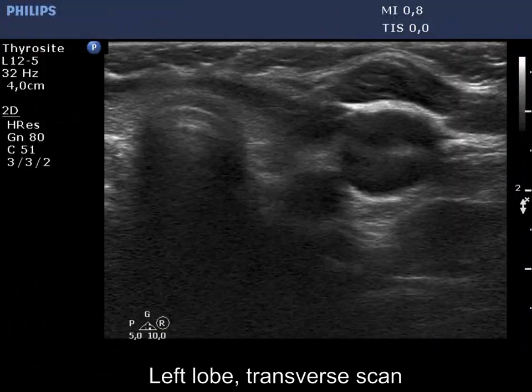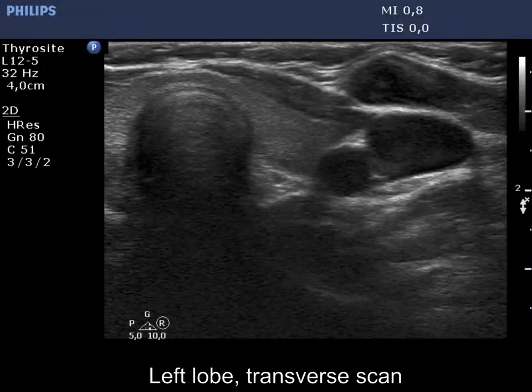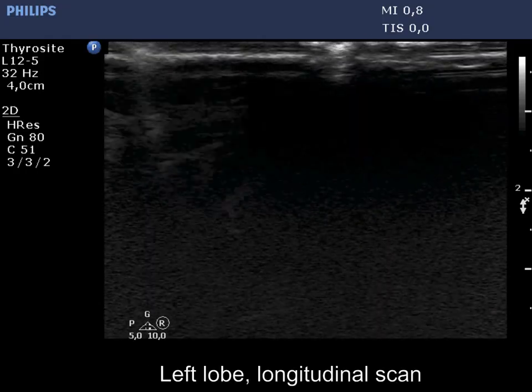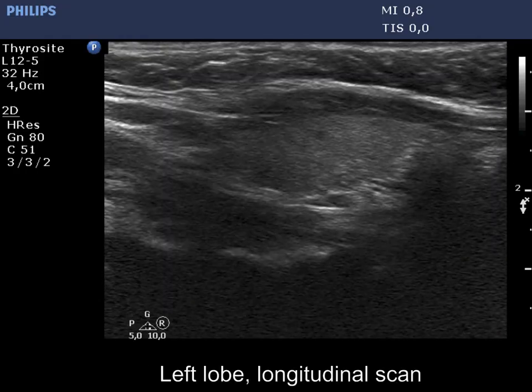The left lobe has some minimally hypoechoic areas, but no lesion of oncological importance is present.